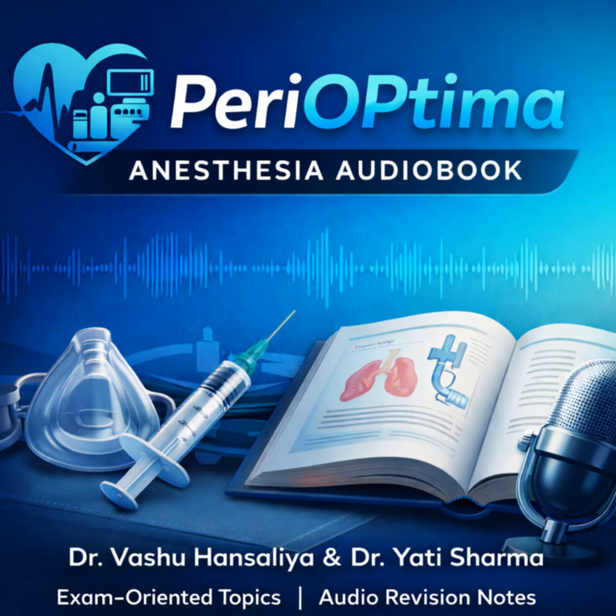Now, for the great innovation, designed specifically for difficult direct laryngoscopy, the McCoy blade. You absolutely have to be able to describe the McCoy in detail. It's a modified Macintosh, but it has a hinged, adjustable tip. Controlled by a lever on the handle. Exactly. So when you're struggling to get a good view, you activate the lever, and that flexes the tip. This elevates the epiglottis, but requires much less vertical lifting force from your arm.